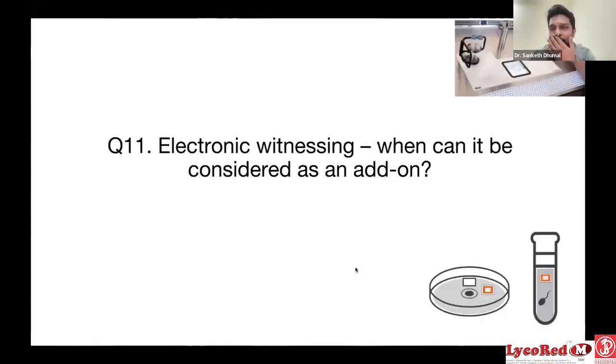Again, electronic witnessing, anybody using, what are the experiences? Do you really feel it is an add-on, or does it have any impact on the practice as well as outcome? I have an electronic witnessing system in my lab, and I don't think it is more than an add-on, because there is no change in our routine practice. They're just good for juniors, not for us. If we're using electronic witnessing, we still have to do double manual witnessing as well. So what is the benefit of this? Basically, it's mental trauma.